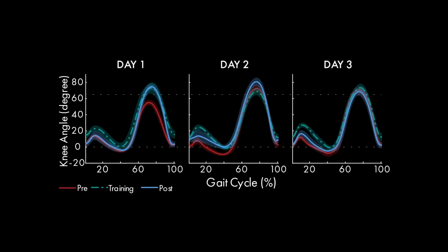Additionally, we see kinematic improvements with a decrease in the stance phase hyperextension and the swing phase peak swing flexion approaching closer to the kinematic target of 65 degrees.